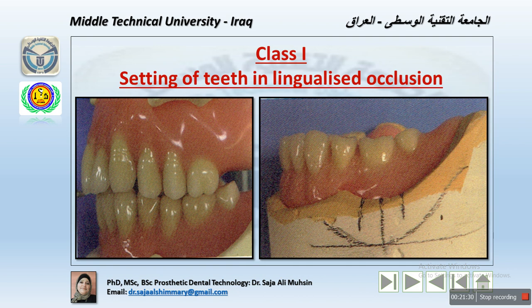In terms of lingualized occlusion, the teeth should be positioned so that they are forced directly at right angle to the ridge. This may mean that they deviate slightly from the occlusal plane and do not conform to the normal compensating curve. The occlusal plane is used only to regulate the correct height of the posterior teeth. Ideally, the largest posterior tooth, the first molar, should be placed over the most stable part of the mandibular ridge. The best analogy for this is a saddle on a horseback.